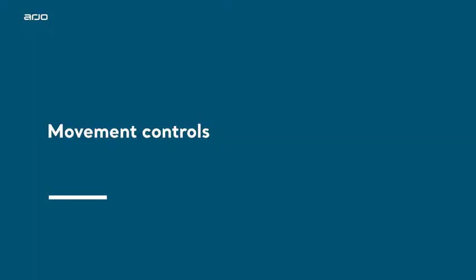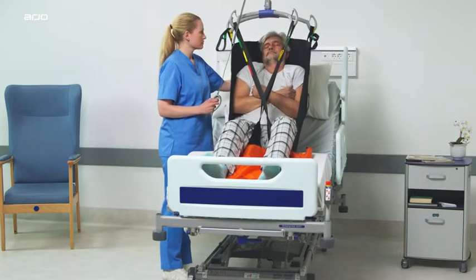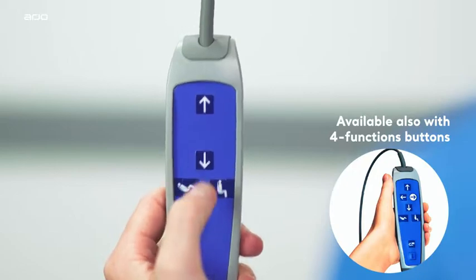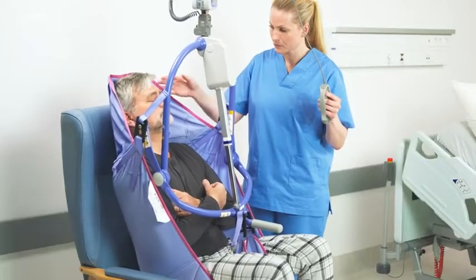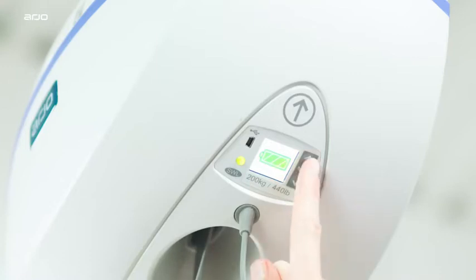Movement controls. Moving the Maxi Sky 2 is achieved with the aid of the hand control, which includes all the command buttons to operate the lift. Vertical movement. The up arrow and down arrow buttons on the handset are used to raise or lower the patient. These buttons are also available for use on the control panel found on the lift.